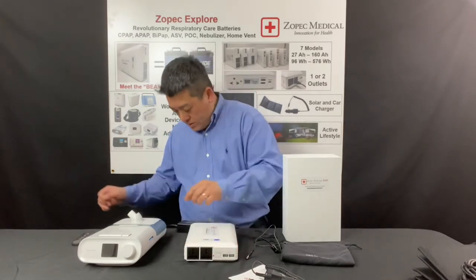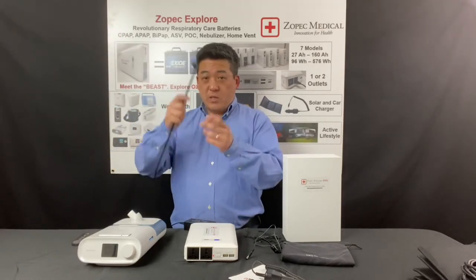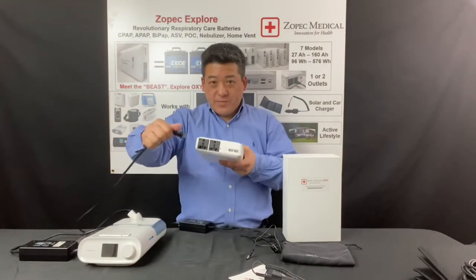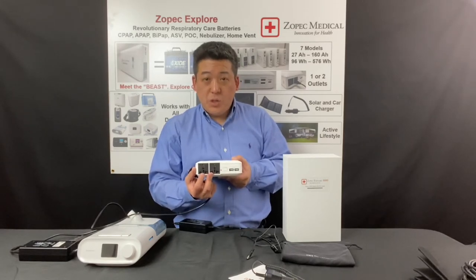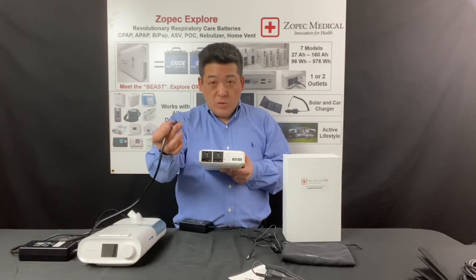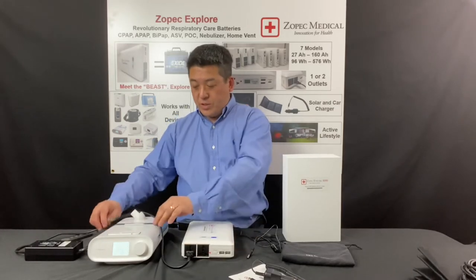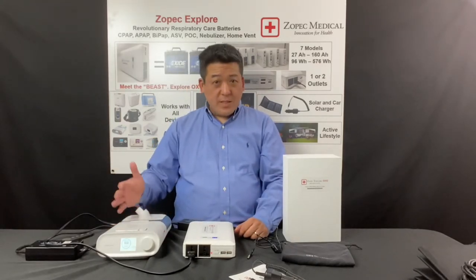To run the CPAP machine, there are no adapters needed. Instead of plugging into the wall normally, you just plug it into the battery. There are two AC outlets in the front — they look a little different because they are universal outlets that can take plugs from all around the world. You just plug it in, and you can see the DreamStation powers up and runs. It's that simple.